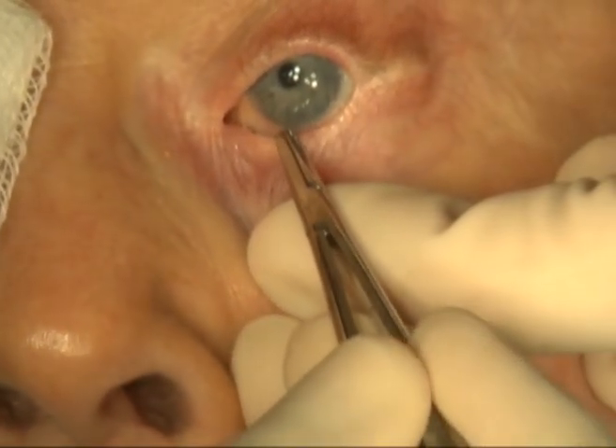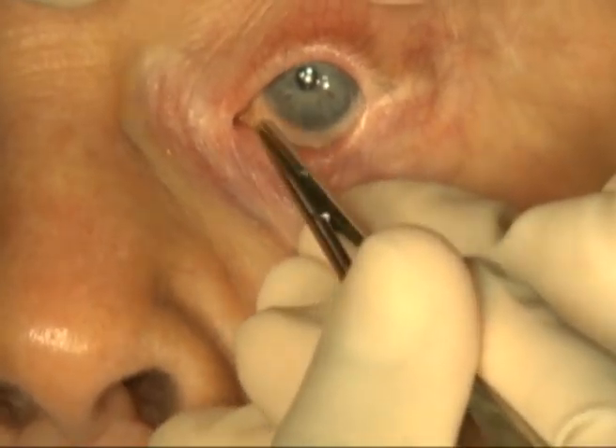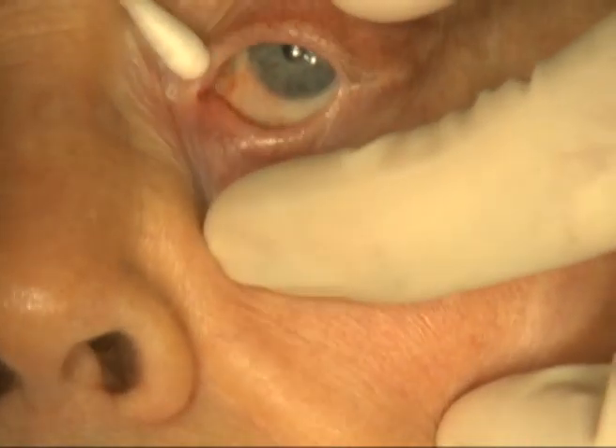Epilation of the lashes is then performed, in this case with a needle holder. Ideally, the lashes slide out with minimal resistance. At the conclusion of the case, all lashes have been removed.